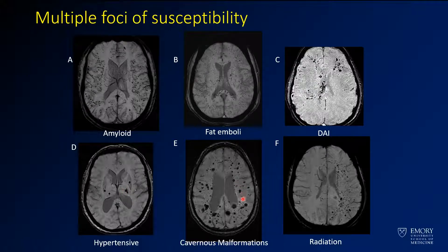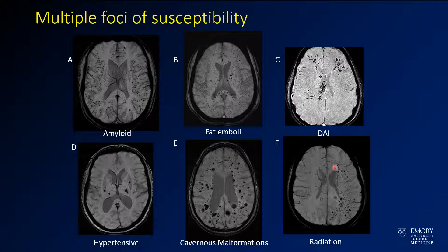For cavernous malformations, you can see they also have a diffuse distribution. One of the differences here is a greater variation in size — you see lesions that are larger — and you would also expect to see more characteristic findings on T1 and T2-weighted imaging. For radiation, the hemorrhages are predominantly confined to one side, as in a patient who had selective radiation to one side of the brain, possibly to treat a glioma or another tumor.